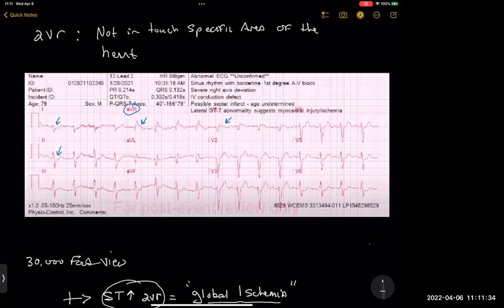And this 12 lead that you're looking at here is actually a pre-hospital 12 lead on a 79-year-old male patient that had pretty substantial history. And the paramedic that took this 12 lead ECG decided to do a STEMI activation. They took the patient to the cath lab, and the patient ended up having substantial left main coronary artery disease, and actually ended up making a save.